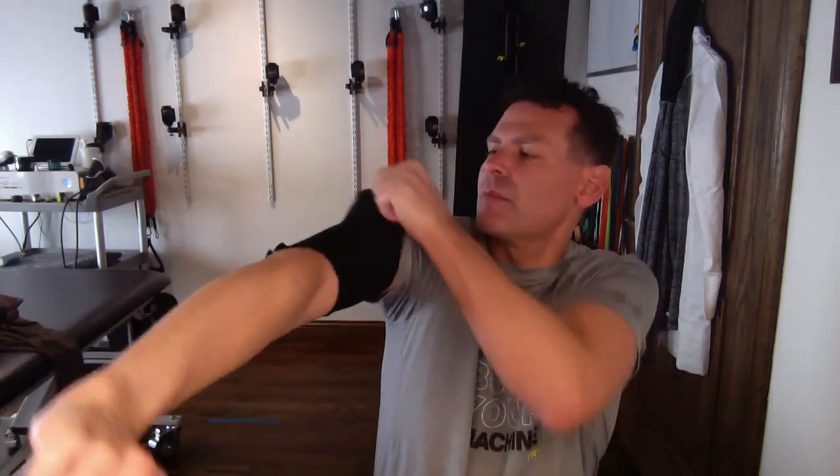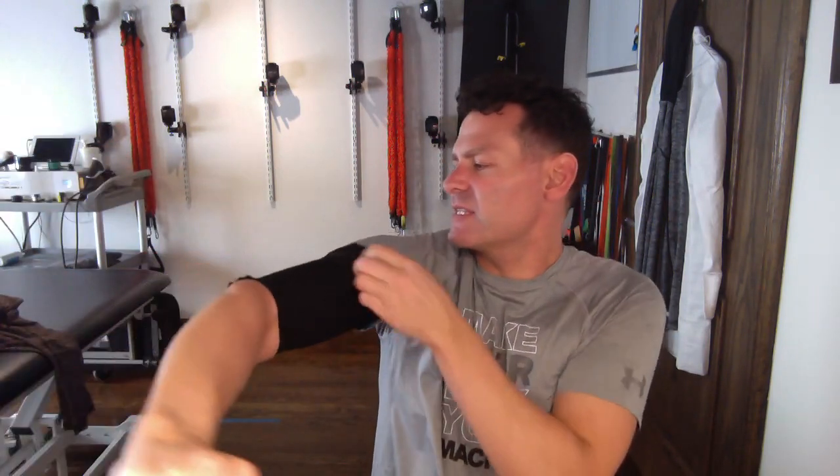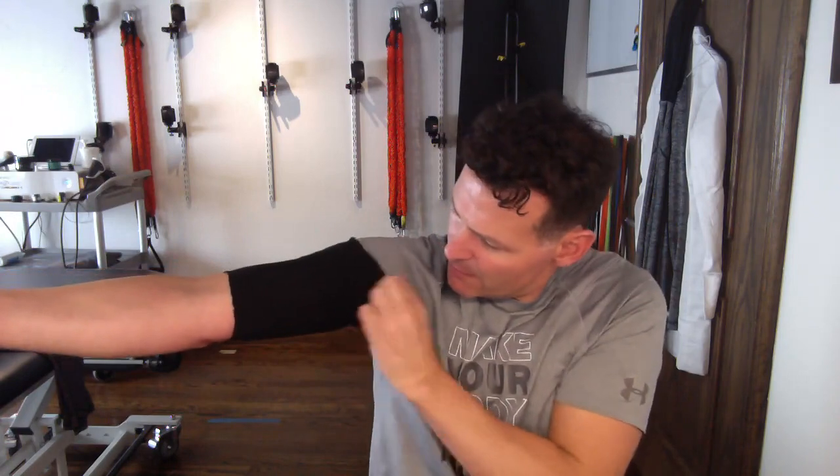I wanted to do this video to show how to find your limb occlusion pressure for your upper extremity when you don't have a Doppler ultrasound. First thing I'm going to do is put a sleeve — this is a two-ply sleeve — to protect my skin, and I'm going to put this onto my upper arm. You can also go on top of a long shirt. If you don't have sensitive skin, a lot of times we'll just go directly on the skin. You can get these on Amazon really easily, dual ply.